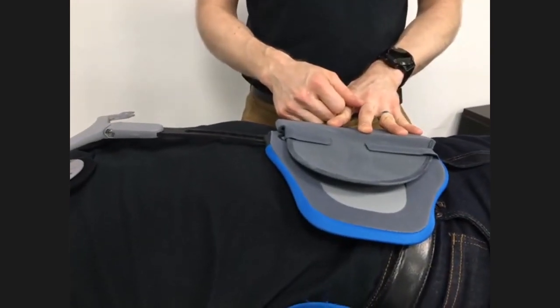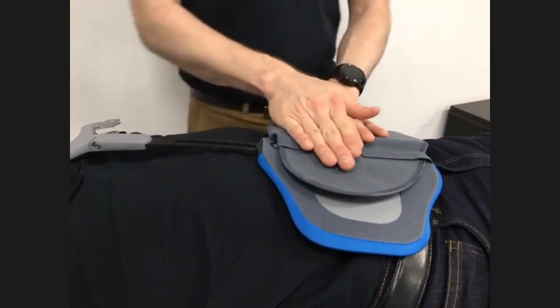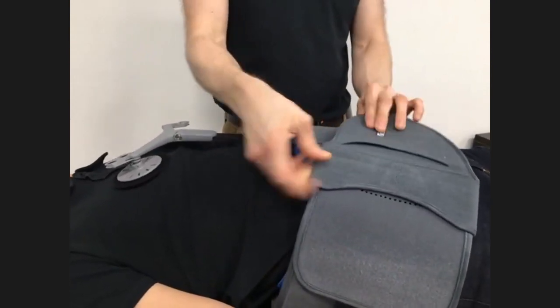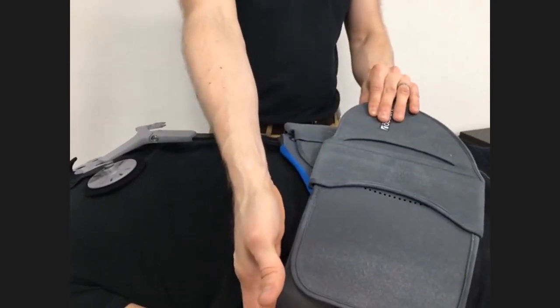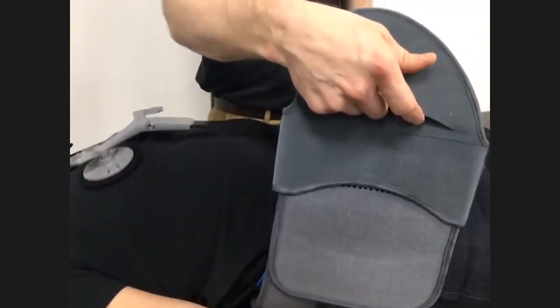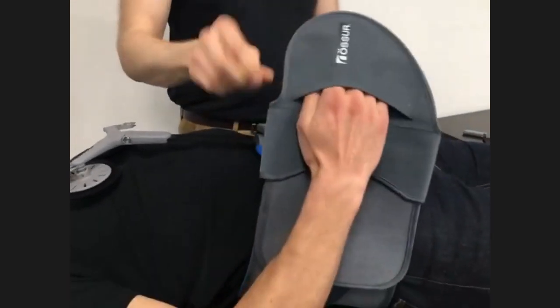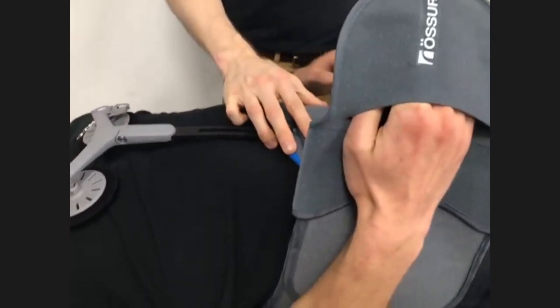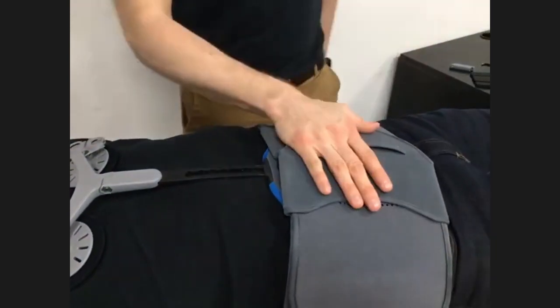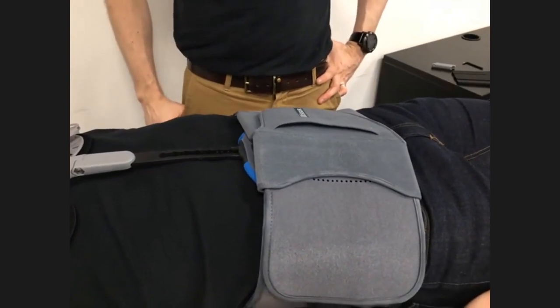Now, if you have a patient that is particularly pear-shaped, so they're wider at the hips but slimmer at the waist, what you can do is change the angulation of these belts. You can bring them down into a slightly oblique position, and it tightens this section here. But when the patient comes to fasten it, Pete, if you can put your hand up on the right, place it in that pocket, and then with this hand you can stabilize the other belt and just fasten it into position. So what the fitting tool has done is meant that we've got this position nicely, and it's dead simple to apply.